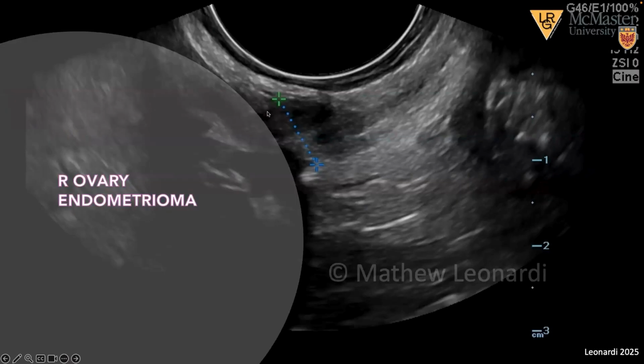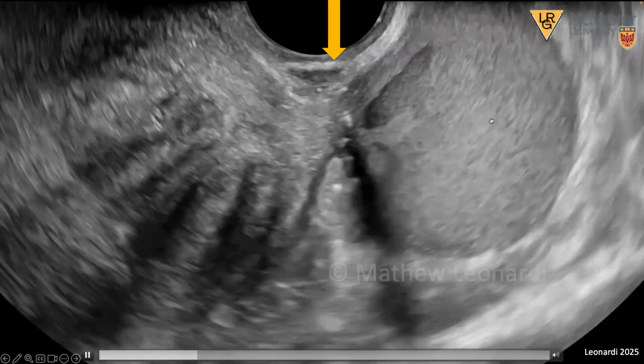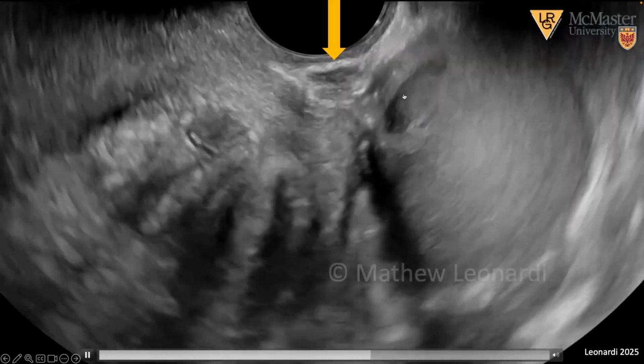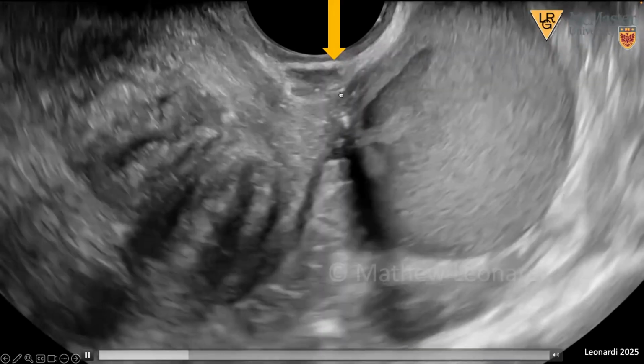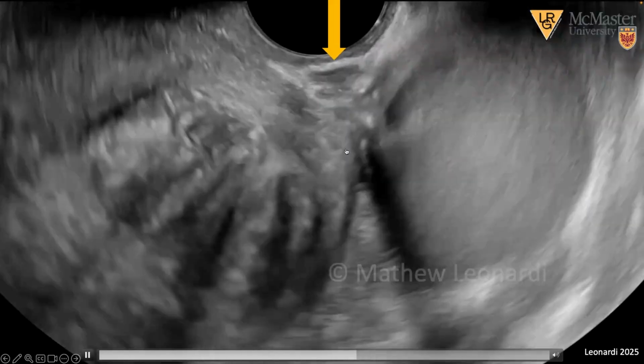We have different variations. Sometimes they're in association to endometriomas. And again, they have this hypoechoic nodular appearance. In this case, it's completely adherent to the uterosacral ligament and endometrioma. Same in this particular case here. We have a classic ground glass endometrioma, and here we have uterosacral ligament endometriosis, very classic low-level echo nodular appearance, stuck with the utilization of the dynamic pressure.